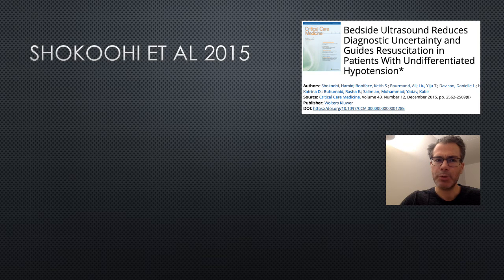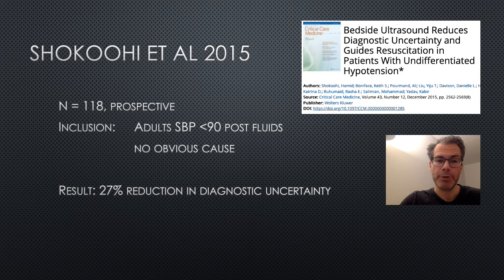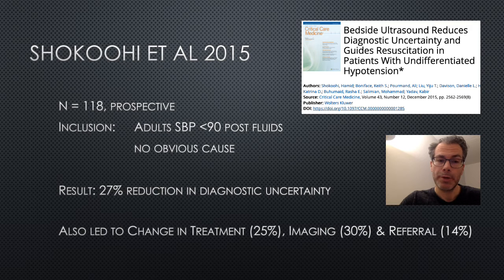And let's start with Shokui et al., who was really born to write this paper, I think. So a relatively small prospective study, inclusion criteria, undifferentiated shock, and the results showed a significant reduction in diagnostic uncertainty. Also, they noted that this led to a change in treatment, imaging, and referral.